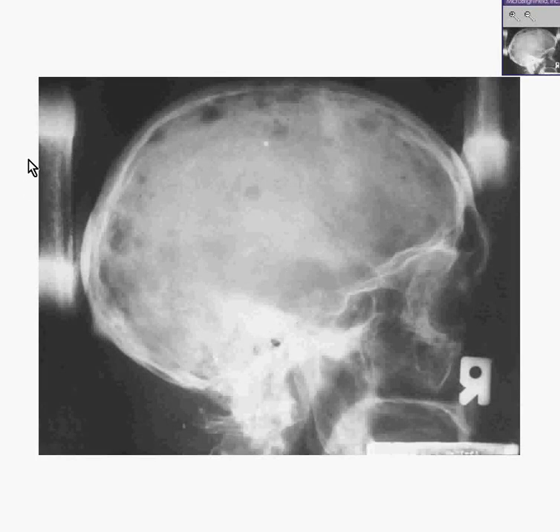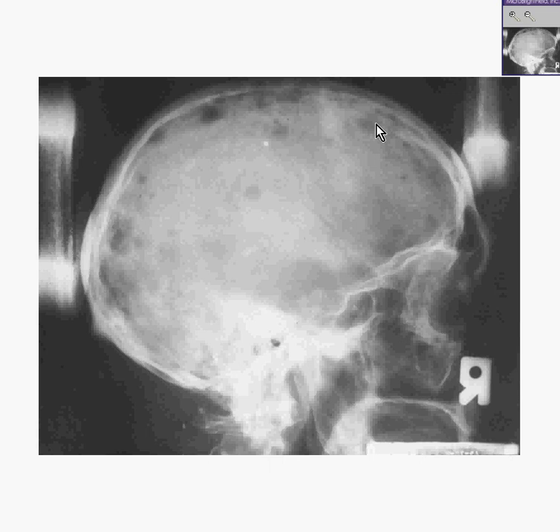If you were to see a skull x-ray like this in which there were multiple punched-out lytic lesions in an elderly person, perhaps with no known primary carcinoma, almost any radiologist would tell you instantly: this is multiple myeloma.